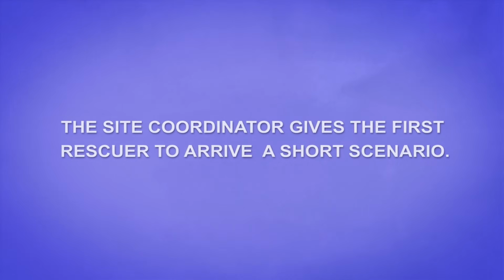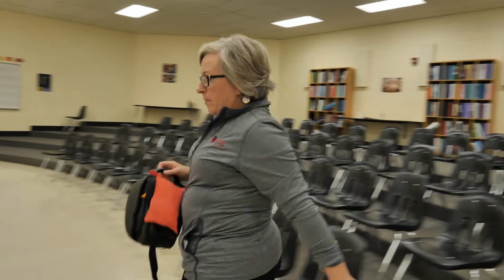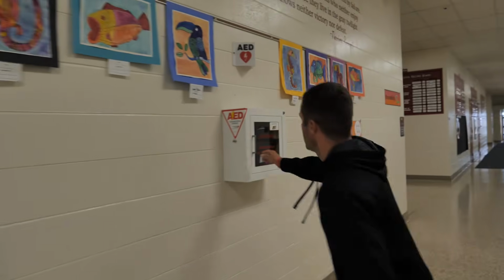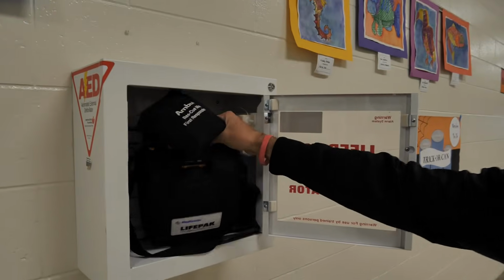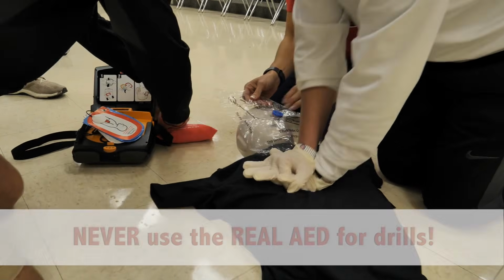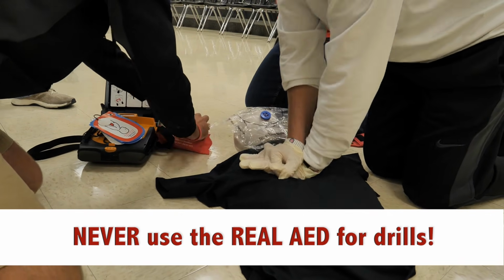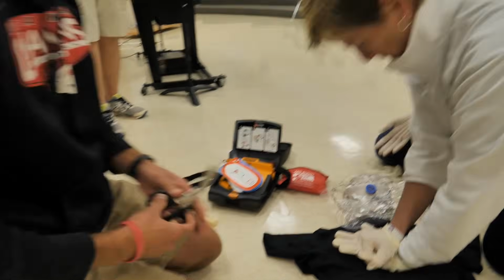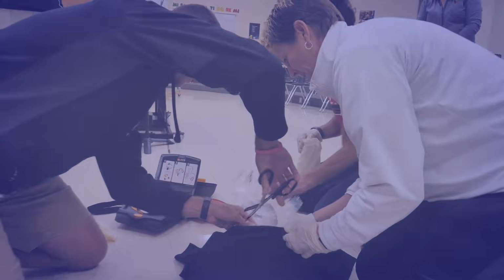The site coordinator gives the first rescuer to arrive, Rescuer 1, a short scenario. The AED training unit is already placed at the drill location, ready to be swapped out with the real school AED, which is brought to the scene. Never use the real AED for drills. Proceed as if this is a real cardiac arrest situation.